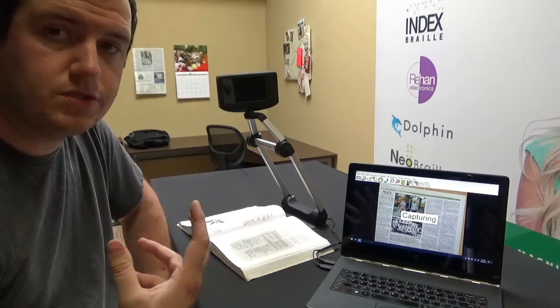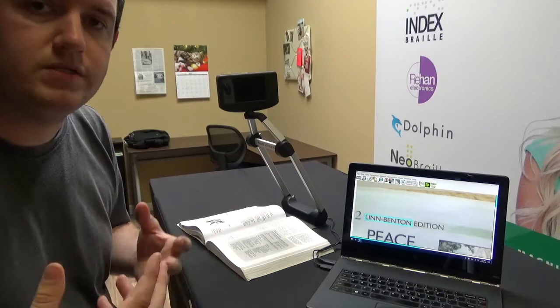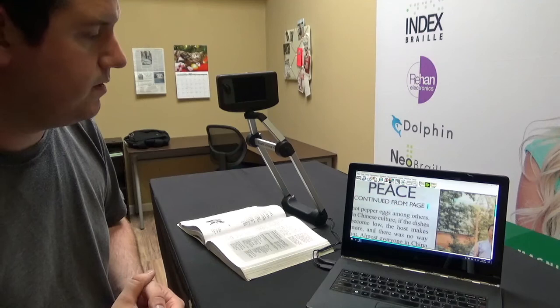There's a nice shutter noise that lets you know that it snapped the picture. And then it's going to begin its recognition process. During its recognition process it does a couple different things. It does page straightening and it also does the OCR process. And then when it's done your document will begin to read to you.